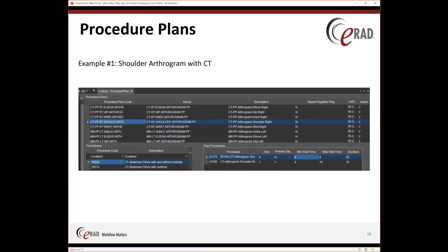Here's an example of a shoulder arthrogram with a CT. Essentially, what they did is they used the fluoro as their first exam but set the CT — which is to be dictated on — as their primary study. That is set to a sequence of 1, and they did a 15-minute max time. They did set their durations to 30 and 15 minutes, so probably the CT is normally a 30-minute exam, but since it got its contrast during the fluoro procedure, they only need 15 minutes to do their scan.